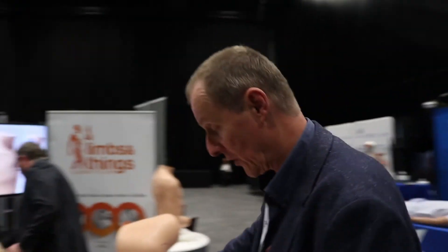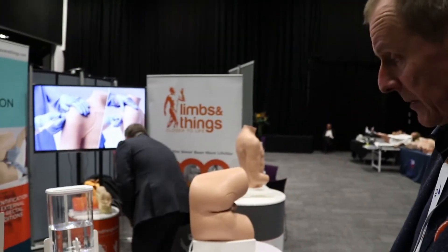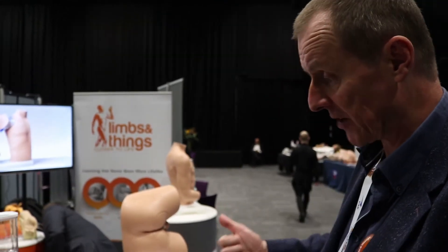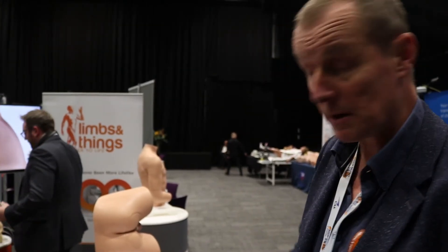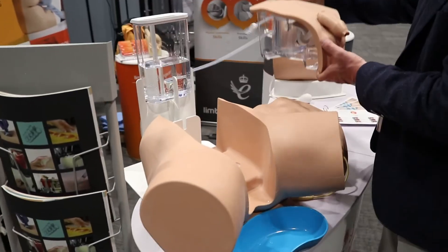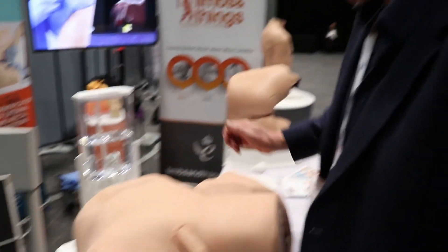It works in exactly the same way as you would work with a patient in terms of the procedural element — same lubricant, same type of catheter — and you just complete the procedure as you would with a patient. The male and female modules are interchangeable; they share a set of hips, so you can take one out and put the other in. And that's the new Limbs and Things catheterisation trainer, available now.